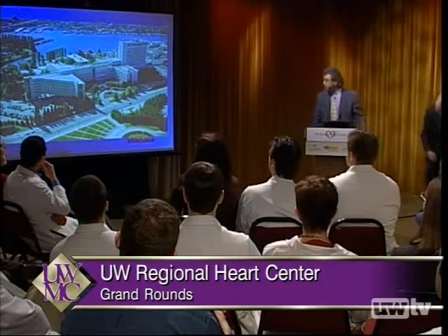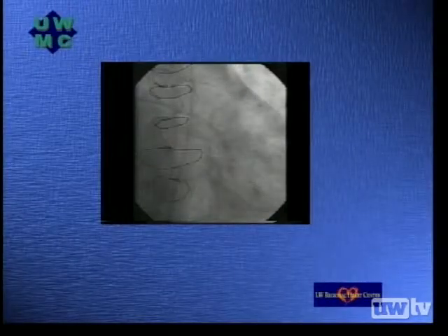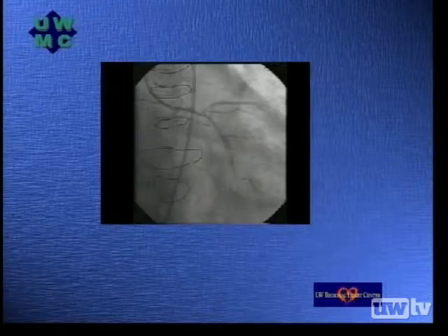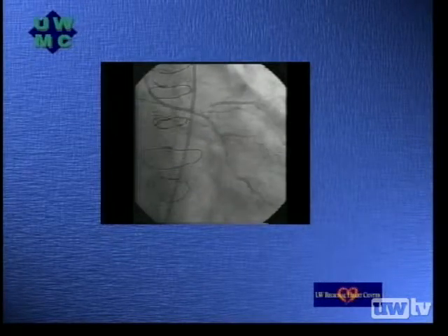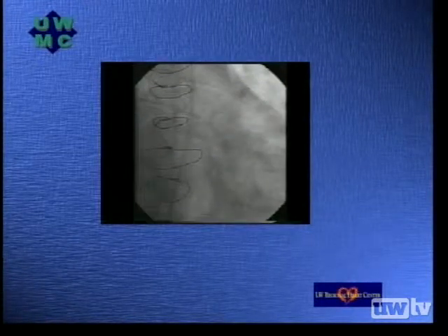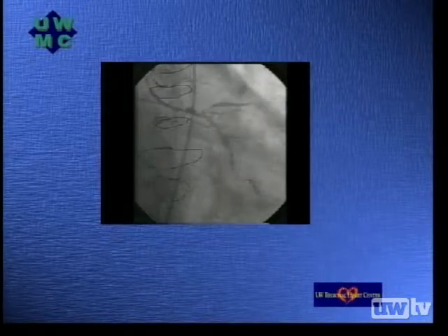Thank you, Dr. Dean. Well, this patient was treated with cutting balloon angioplasty and brachytherapy, or intravascular radiation therapy. Cutting balloon has become popular lately to treat in-stent restenosis for a couple of reasons. One, the cutting balloon, which is a balloon with 4 microtome blades bonded to it, cuts into the plaque as the balloon is inflated. And with in-stent restenosis, this anchors the balloon so it doesn't slip or watermelon seed beyond the stenosis and is useful.